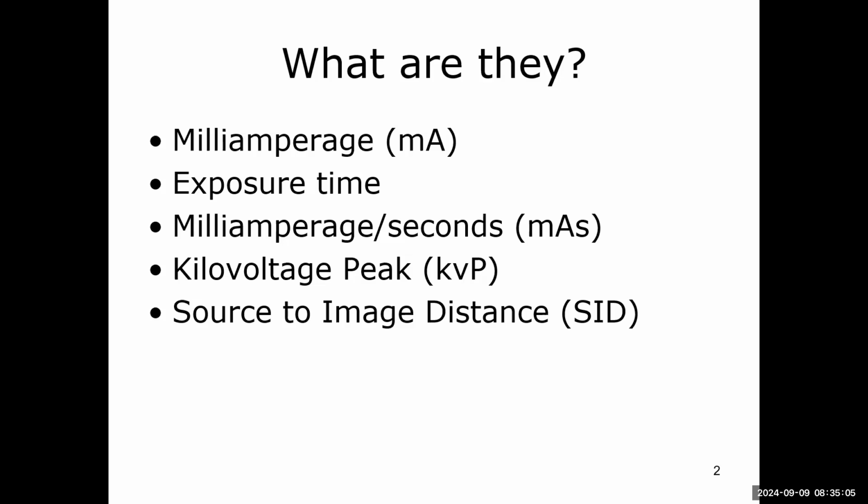It starts at about 11. Why is that? 10 inches with the x-ray tube. Yes, it has to take into consideration the distance from where the measuring tape pulls out to where the source of the x-rays actually is, which is about 10 or 11 inches difference. So that's why it doesn't start at 1.